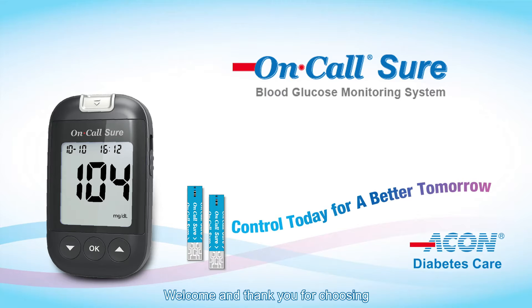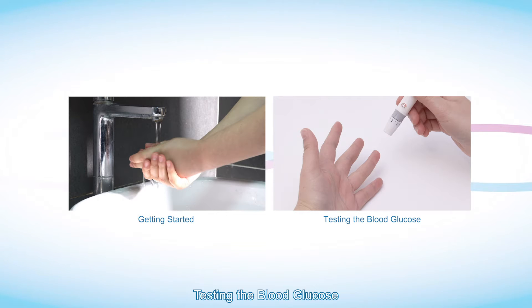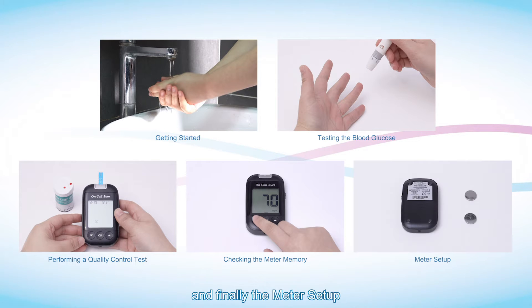Welcome, and thank you for choosing On-Call Sure Blood Glucose Monitoring System. Please read the user's manual carefully before use. The video demonstrates the usage of the device, covering: getting started, testing the blood glucose, performing a quality control test, checking the meter memory, and the meter setup.